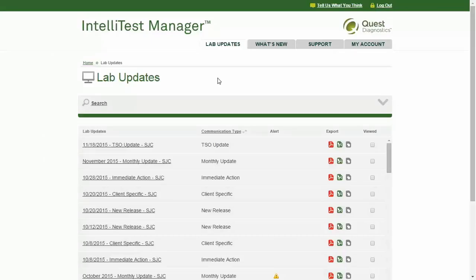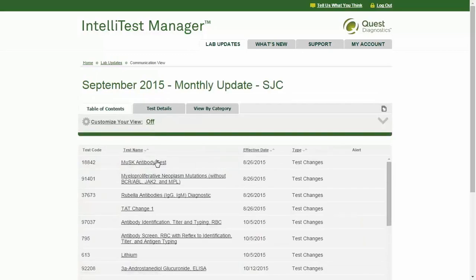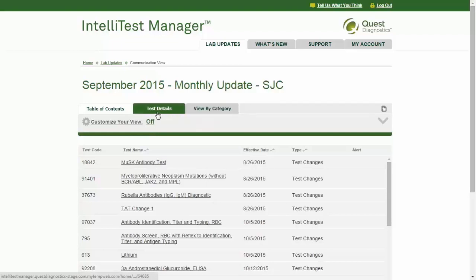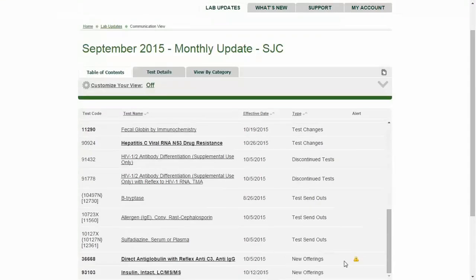While on the Lab Updates page, click on the title of a communication to view its details. Each communication contains three tabs providing different ways to view the information. On the default tab, Table of Contents, you will see a listing of all tests covered in the communication, their effective dates, and the type of communication. New offerings include the most detailed amount of information; to see these details, click on the test name.